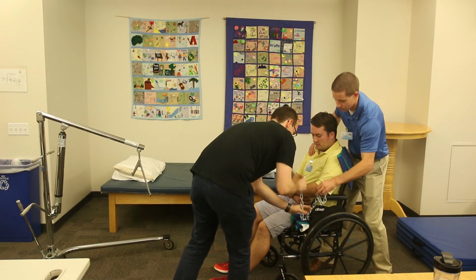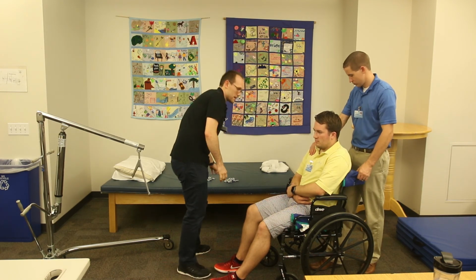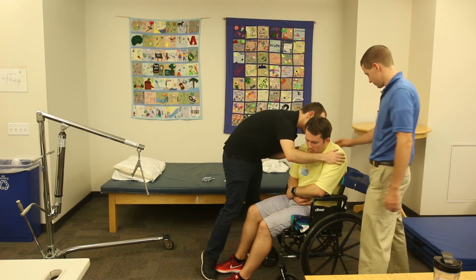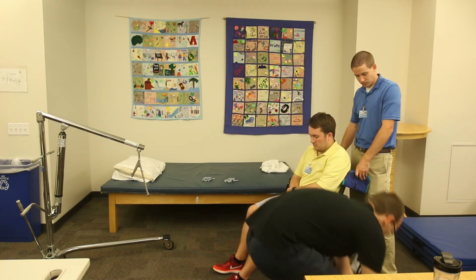Thank you, Dylan. How is your positioning in there? Do you feel like you're all the way back? Yeah. Okay, I'm just gonna check, just to make sure. Okay, you're all the way back there. I'm gonna get your foot plate on there, and then we can get you out of here.